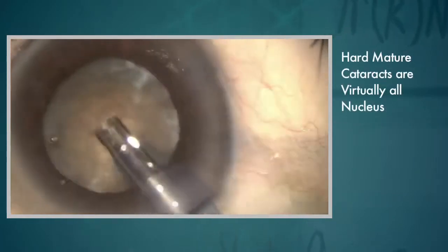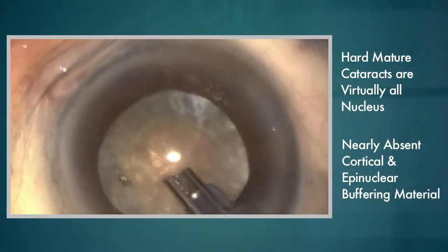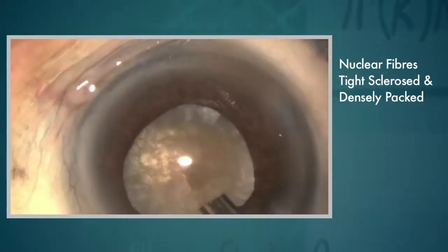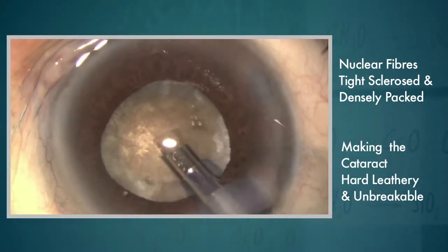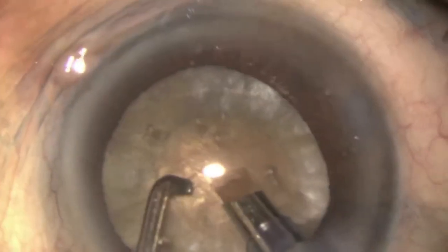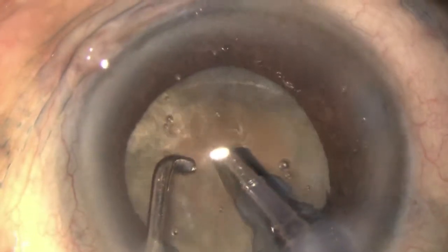Hard mature cataracts are virtually all nucleus with nearly absent cortical and epinuclear buffering material. Nuclear fibers are tight, sclerosed and densely packed, making the cataract very hard, leathery and unbreakable. It's always been a challenge to achieve full-thickness nuclear segmentation in sclerotic, leathery, hard mature cataracts with the current surgical techniques.